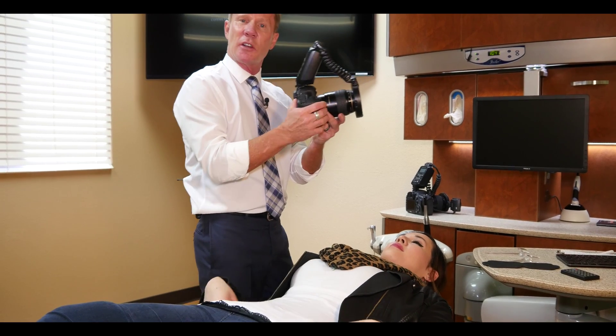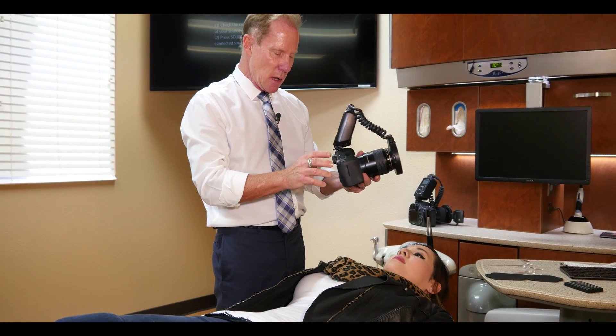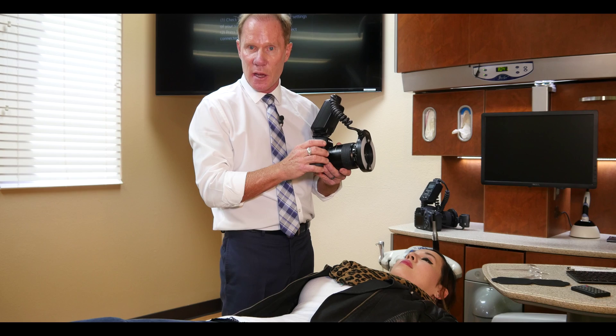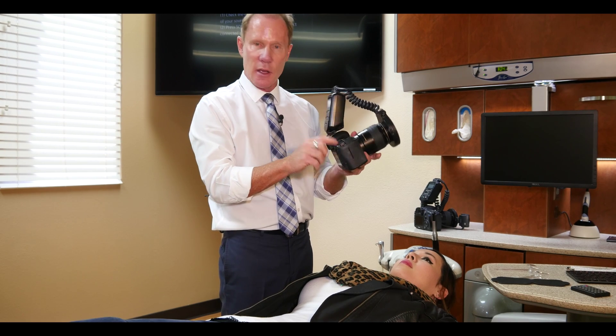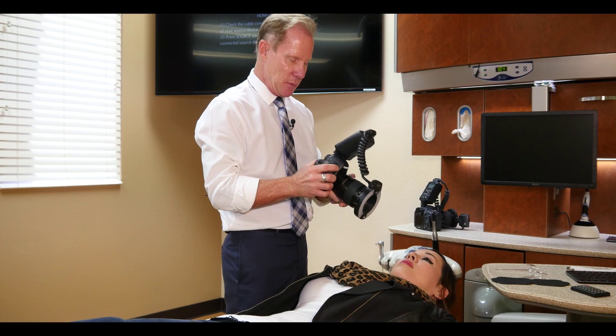On this camera, we're going to use the ring flash. We're going to shoot at a shutter speed of 60 and an f-stop of 32. F-stop 32 will give us our greatest depth of field.